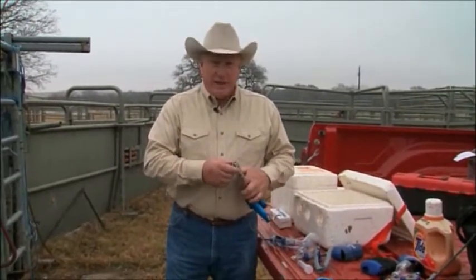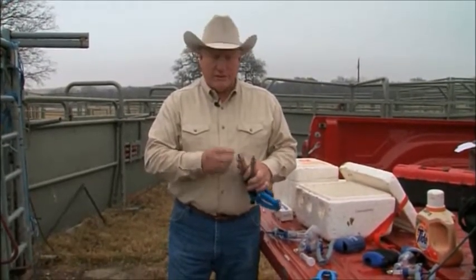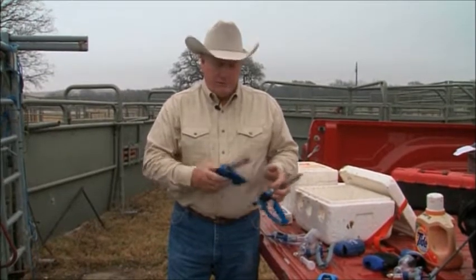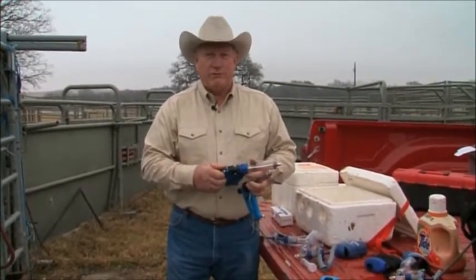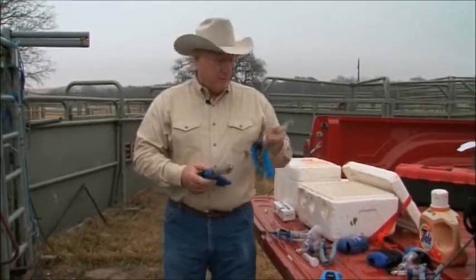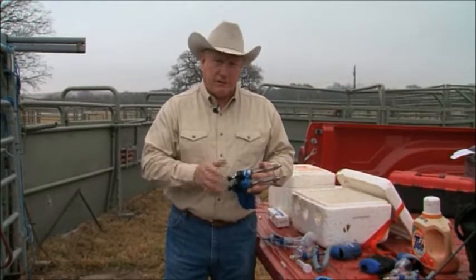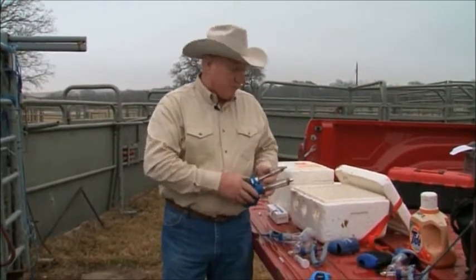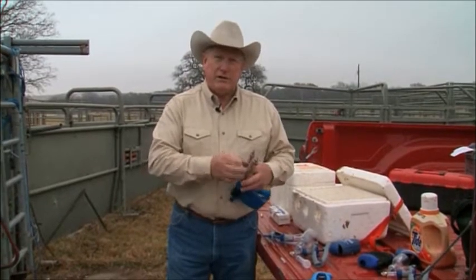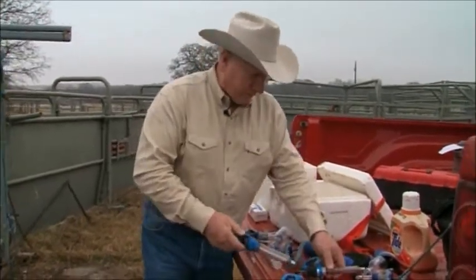The other thing, most cattlemen are not prone to change the syringe very often. We recommend we change at least every 10 head. And if you're using a syringe, you'll normally go through 25 before you change. So these will at least get you to change every time you fill your syringe, and that's a really good practice and protocol to have, is every time somebody goes back into a vaccine bottle, they change the needle on the syringe. So that'd be the appropriate way to do that.